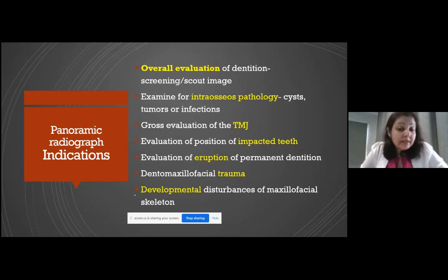And of course, a very vital tool in dentomaxillofacial trauma. So I'm not talking about head injury, I'm just talking about dentomaxillofacial trauma. It can act as a very good screening tool. And of course, if the trauma involves more intricate areas of the maxilla, sometimes you might have to go in for a CT scan. And also for viewing developmental disturbances of the maxillofacial skeleton.